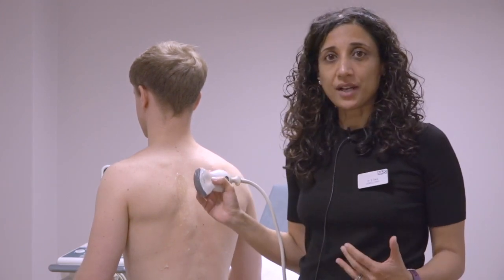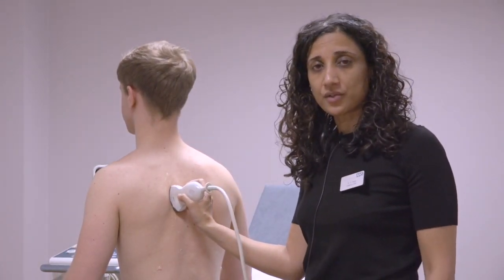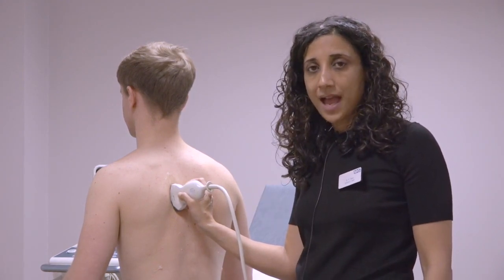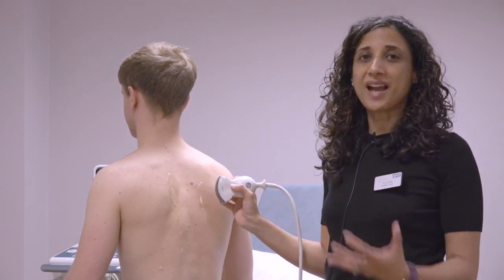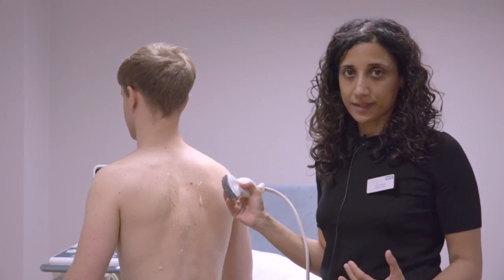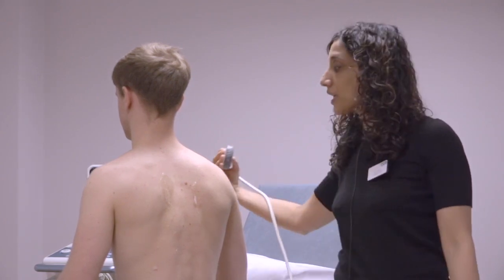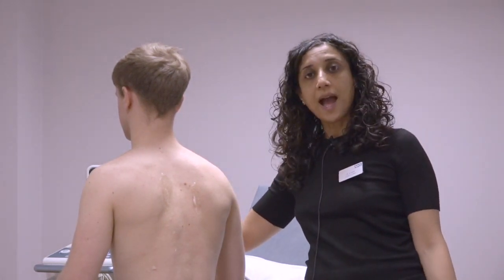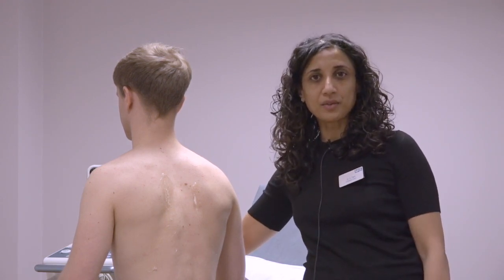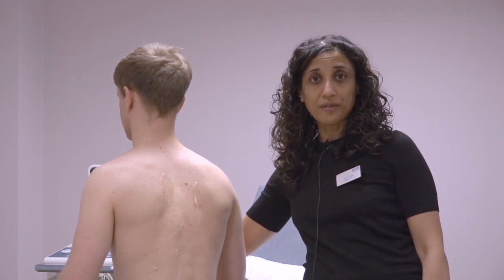So what we've been doing in our trust is scanning posteriorly if we can. As I described in my first video, start from the back in a lawnmower approach. However, if the patient is very sick, you can scan them anteriorly, but you need to make sure that you are well protected. The other thing you could do is, whilst standing posteriorly, come across and scan anteriorly, but stand posteriorly from the patient to make sure that any coughing or sneezing is away from you.